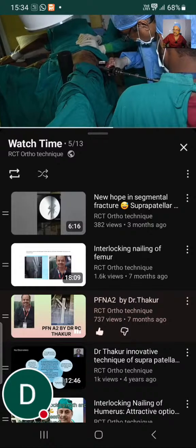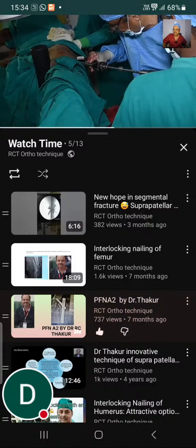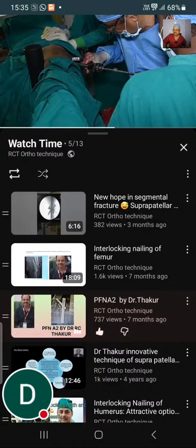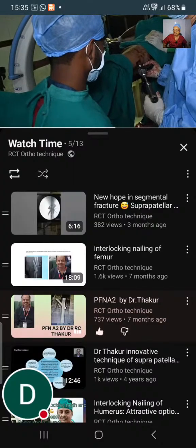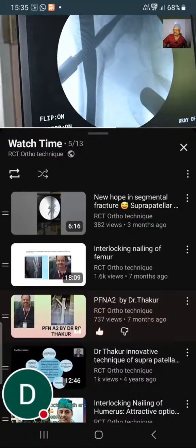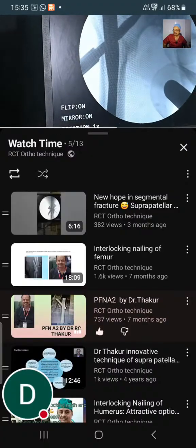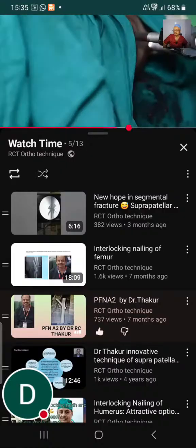I am doing reaming. Some surgeons do reaming up to the lateral cortex only, but I do reaming up to the size of the nail selected. So I have reamed.